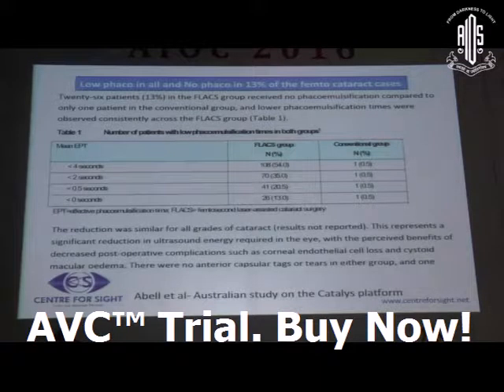Now, when you come down the ladder, this study has shown that zero seconds of phacoemulsification time after the femto could be achieved in 13% of the cases and was achieved in only 0.5% of the cases in phacoemulsification. Do you understand? These are softer cataracts. I will show you how you don't actually need any phacoemulsification power.